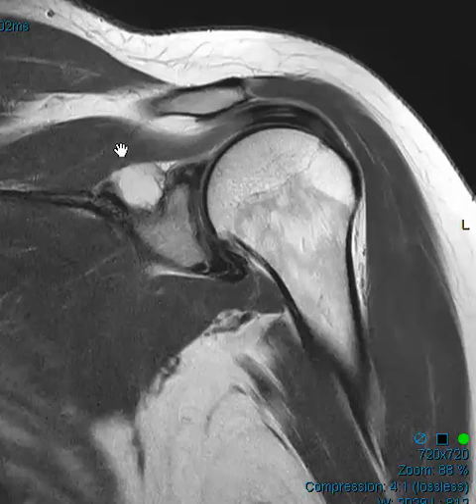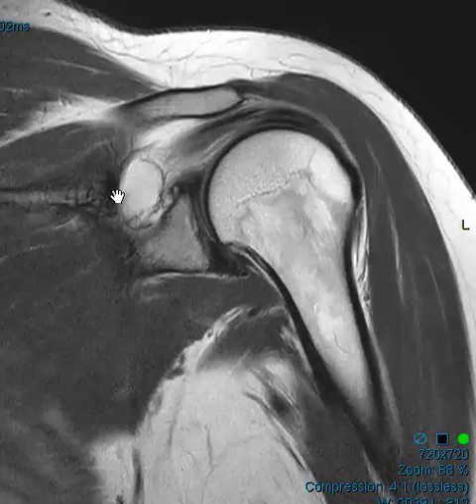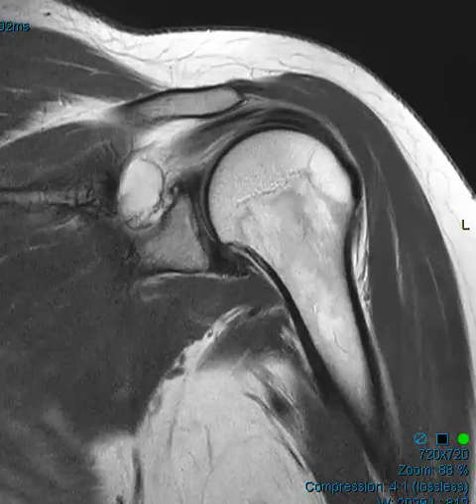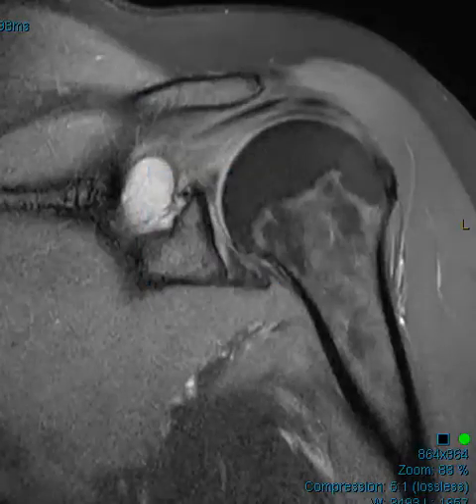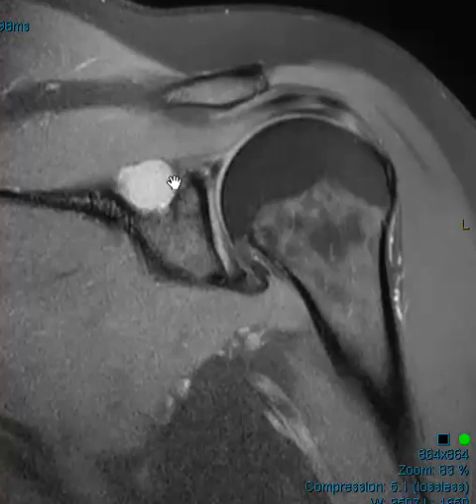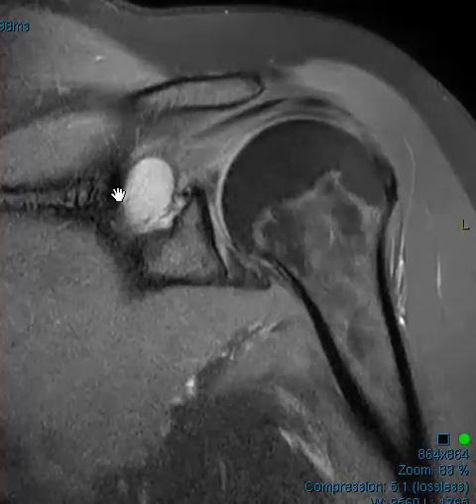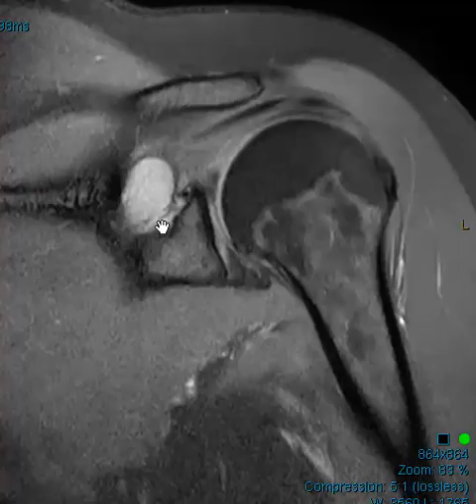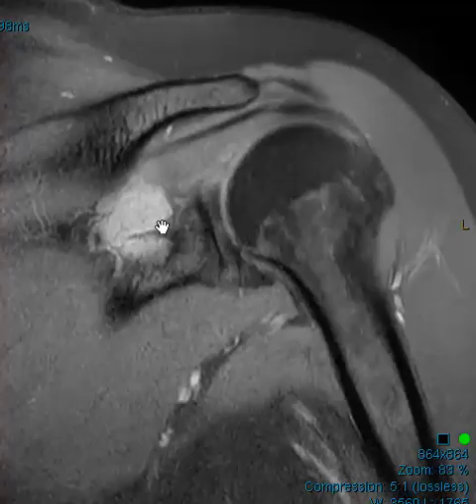This is in the spinoglenoid notch. When we see something here, we want to put up the fluid signal intensity sequence to see if this is fat or fluid. Here it's fat-suppressed — this did not suppress — so this is definitely fluid, and that's what we would expect in the spinoglenoid notch. Typically you get fluid collections here.